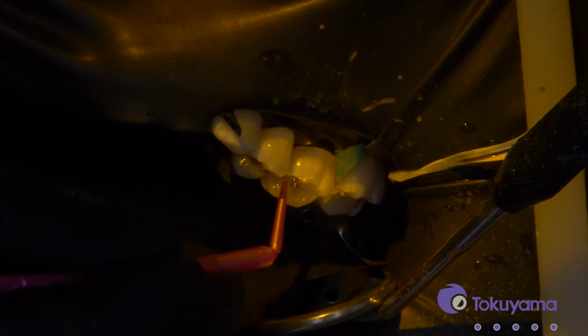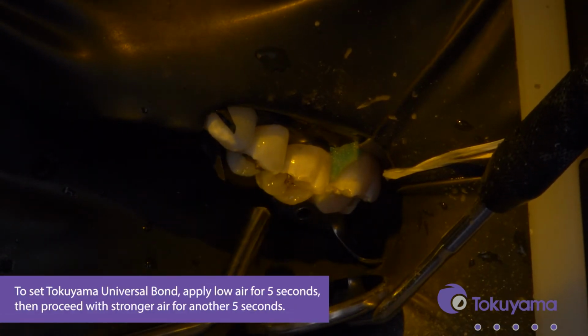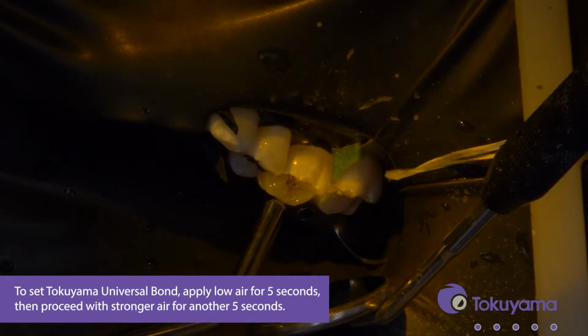Now I'm not scrubbing the bonding agent, I'm just trying to make sure that it's completely covering my preparation. Start with a thin, light gust of air here, and then after about 5 or 10 seconds, you can increase the intensity of the air all over the preparation until you see no movement of any bonding agent. When you see that, we're ready to roll.